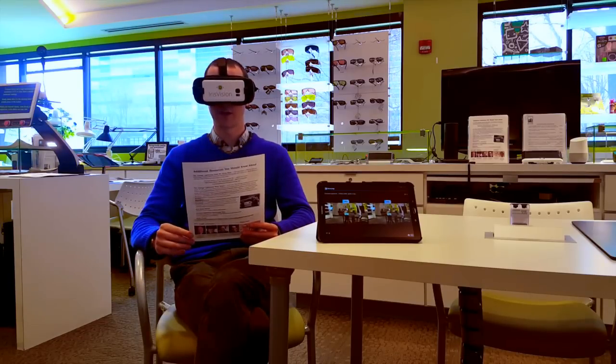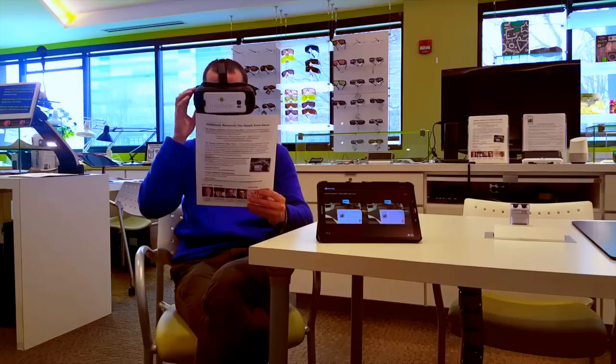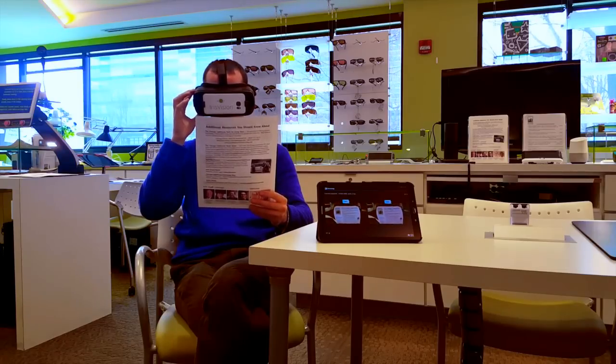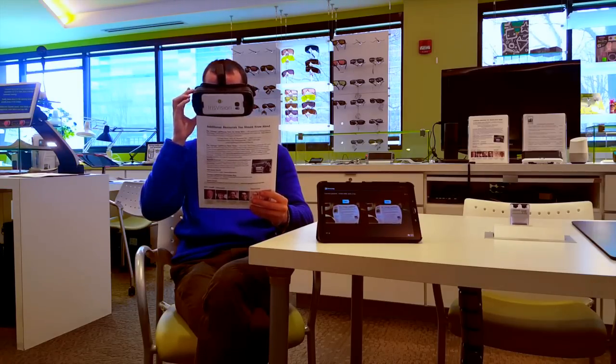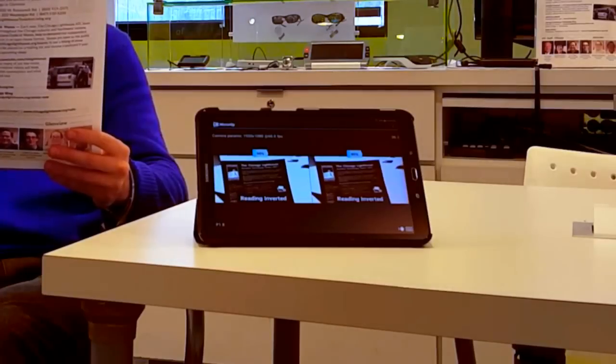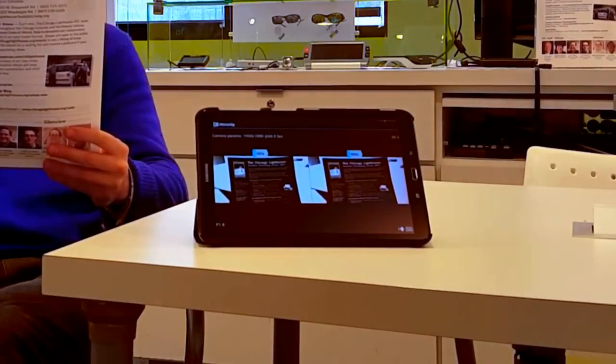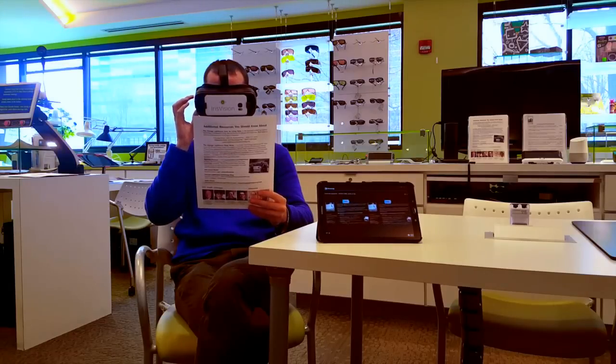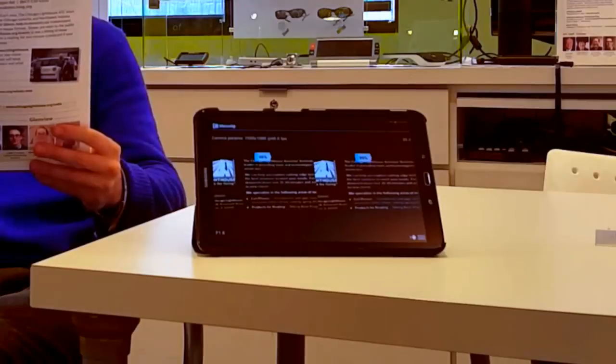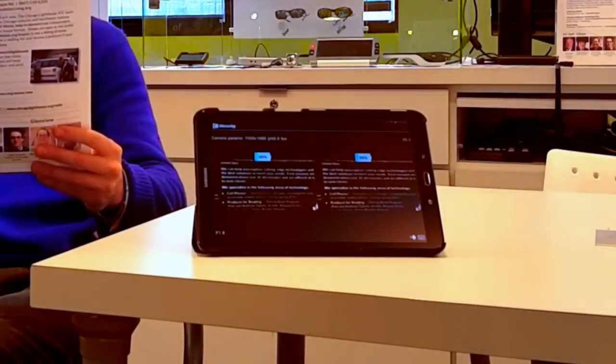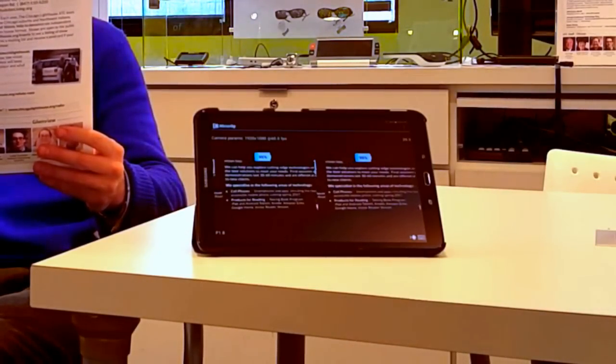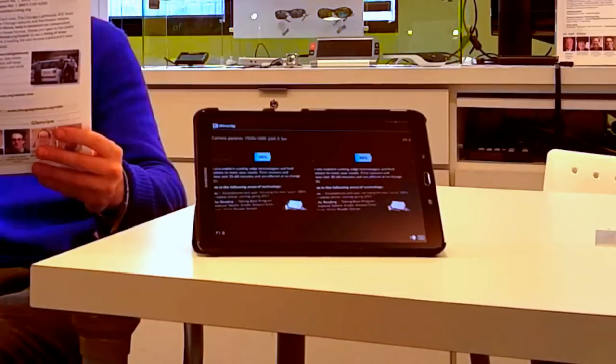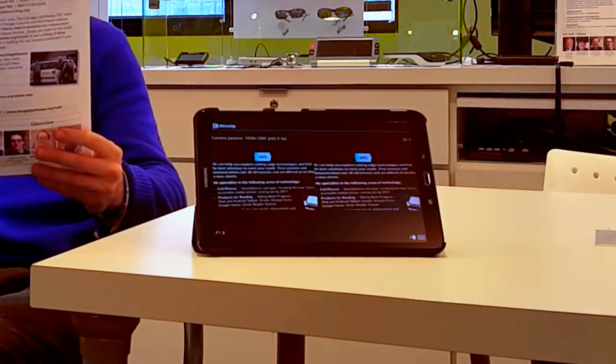So let's give that a try. I'm going to hold this up in front of me, and it's just focused. As before, I'm going to press a button on the side here, and now we've gone into this inverted reading mode, which is really cool. So I'm going to go ahead and magnify, and I can see this really well. So, we specialize in the following areas of technology: cell phones, smartphones, and apps, including the new Lucia 100% accessible mobile phone coming spring 2017.